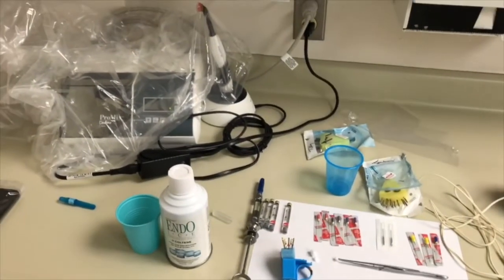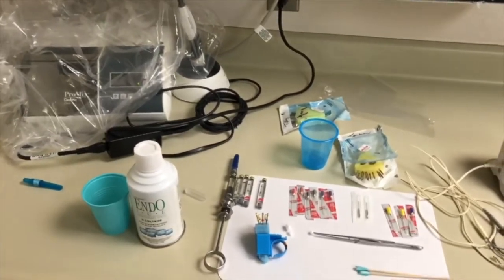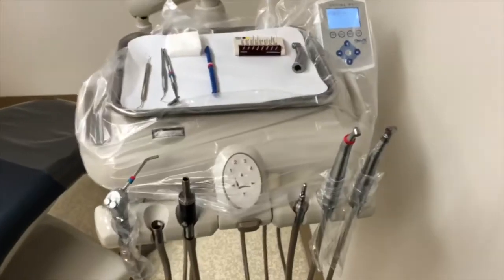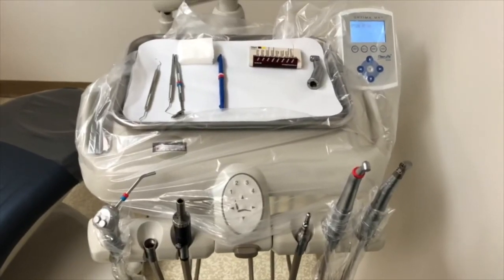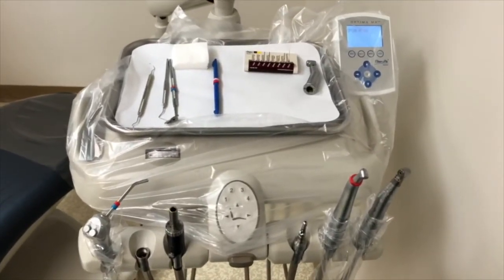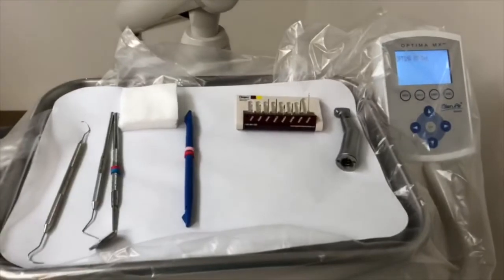Our amalgamator and curing light is ready to go as well. Moving over to the operator tray — just a minimal setup: exam with the tooth sleuth, and our endo access kit that we will review.